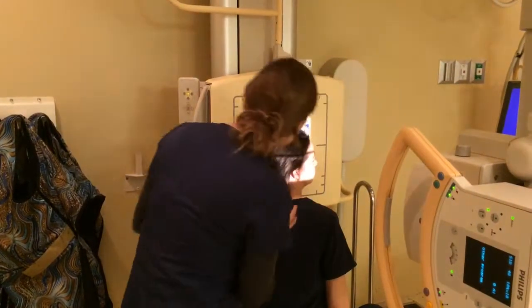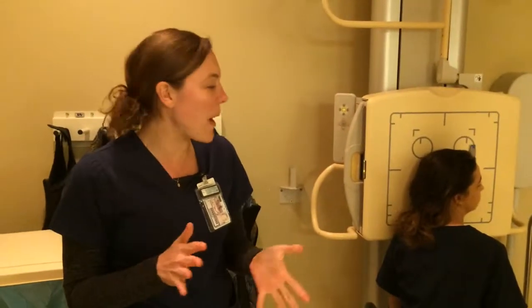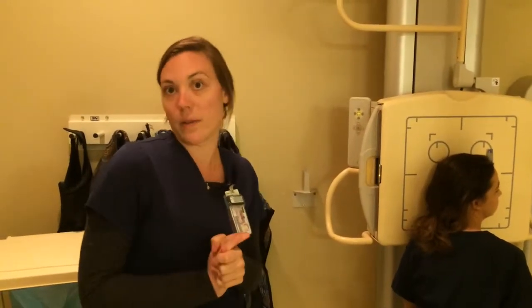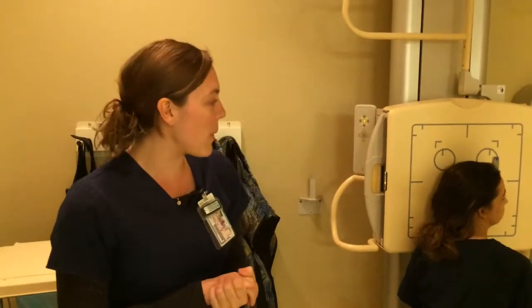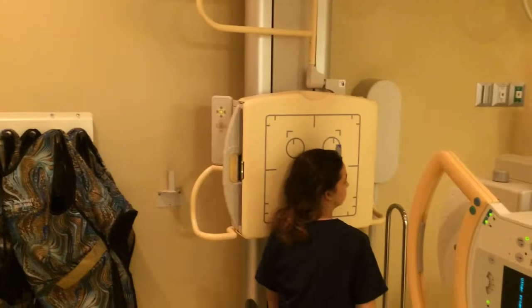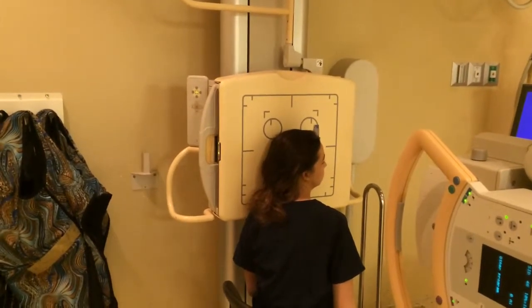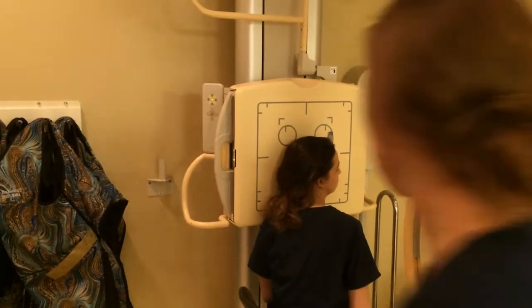On my console, I have set 85 kVp for about 6 to 8 mAs, depending on the size of your patient, on the wall bucky. All right, so just don't breathe, don't move, X-ray. Okay, now we can move on to the next image.